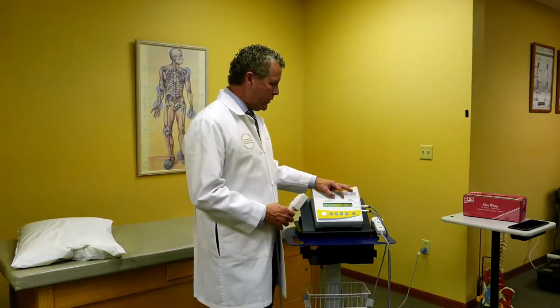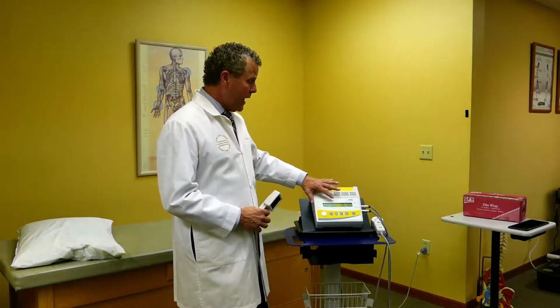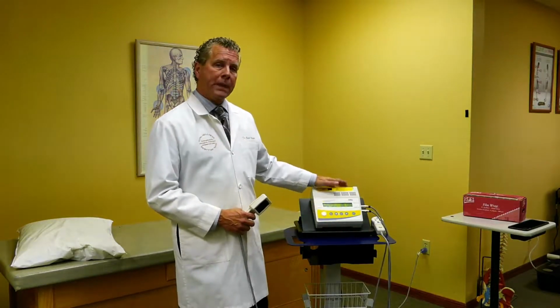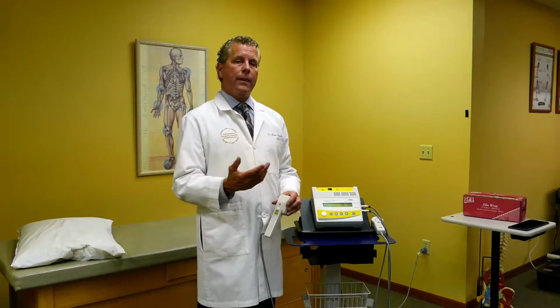What I have found by using Multi Radiance equipment now for over 7 years is that we have a mode here for sweep. I'm a big component of sweep modes because we know that tissue will build up an adaptation to one particular wavelength or one particular frequency. So if we're varying the wavelength and the frequency, the cell is less likely to build up an adaptation.